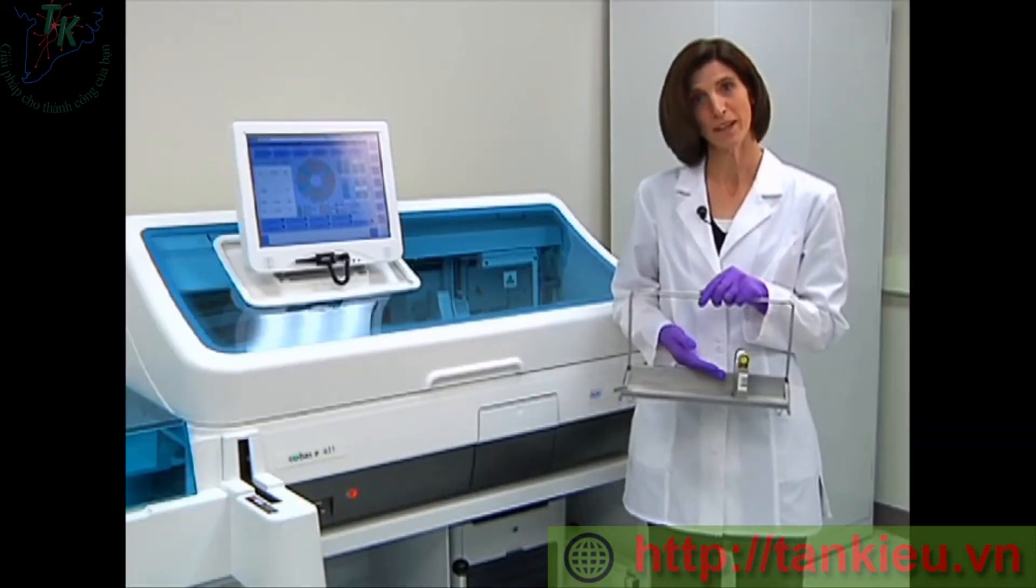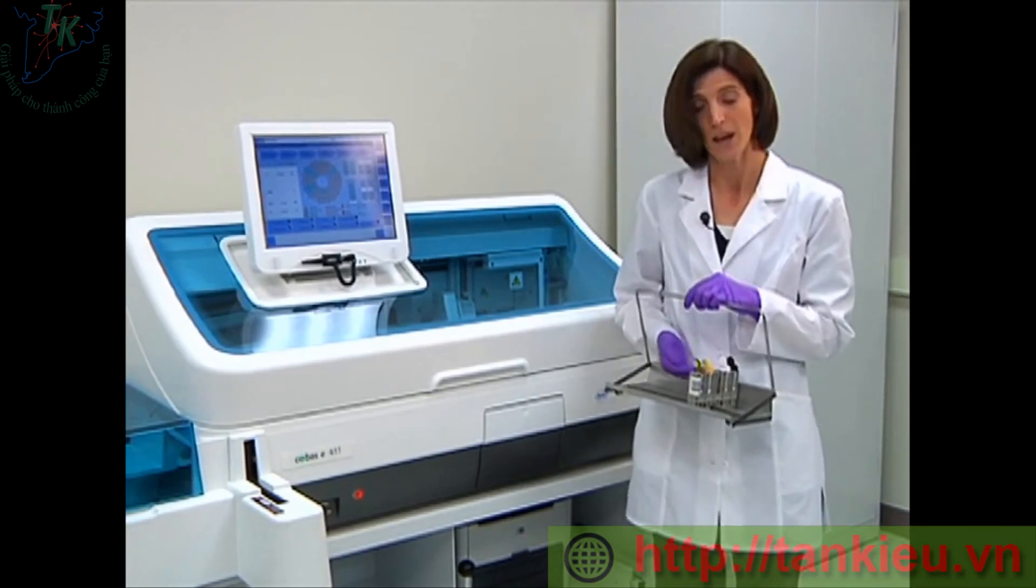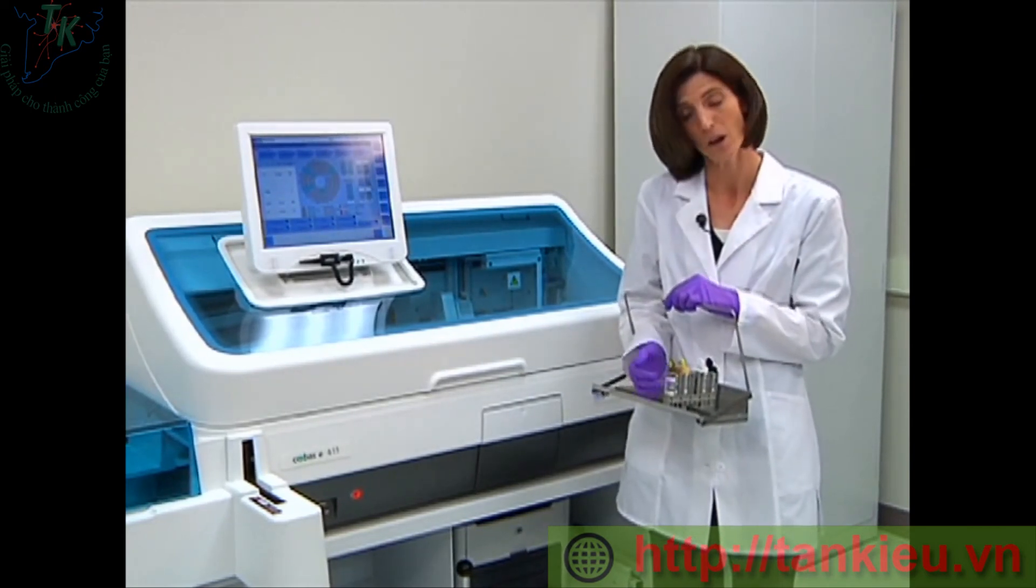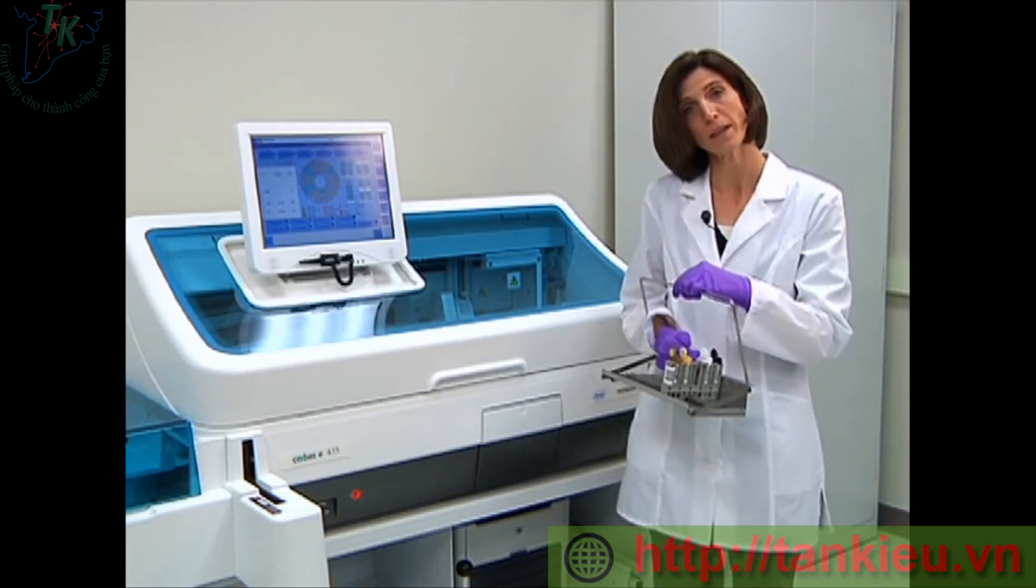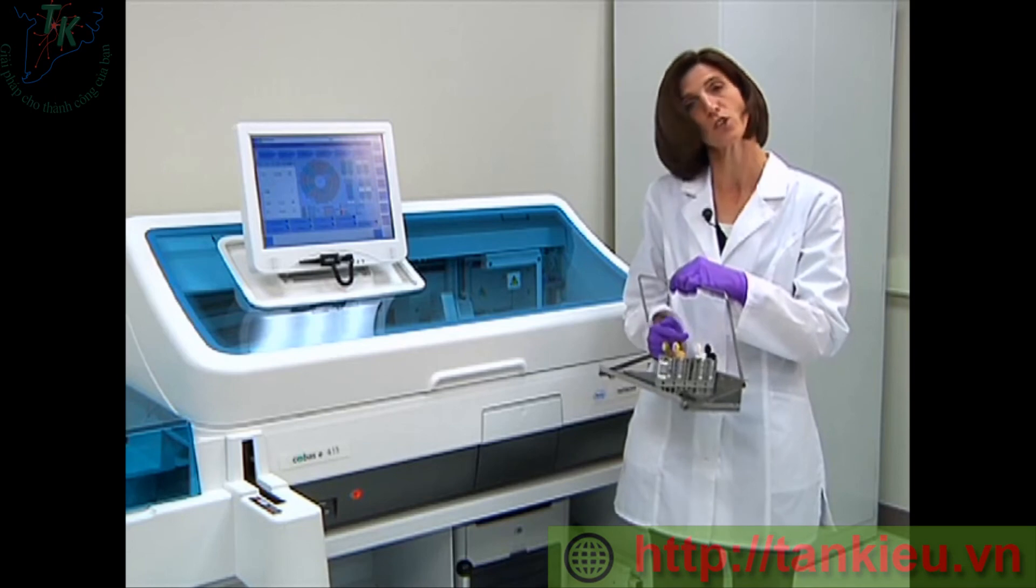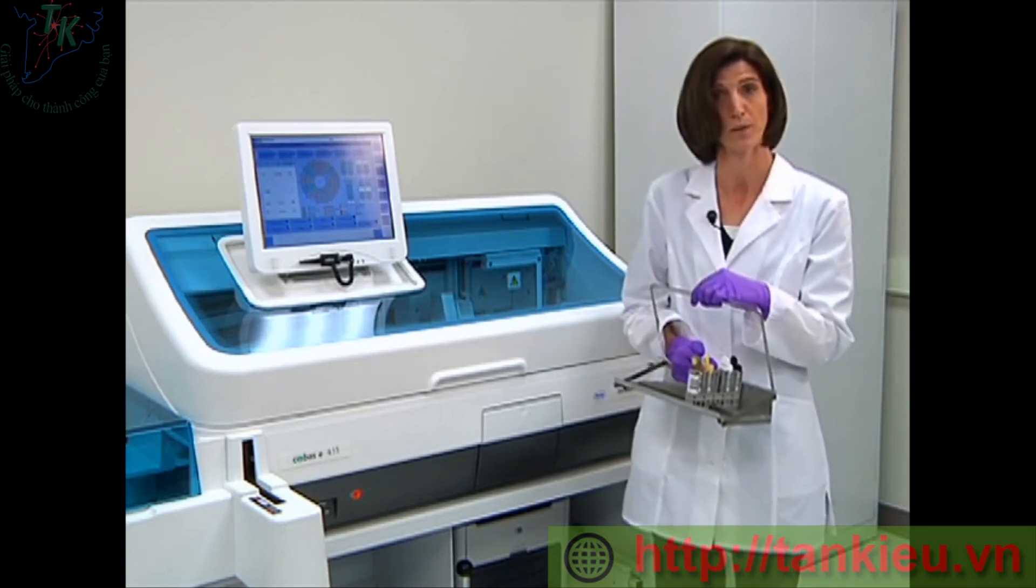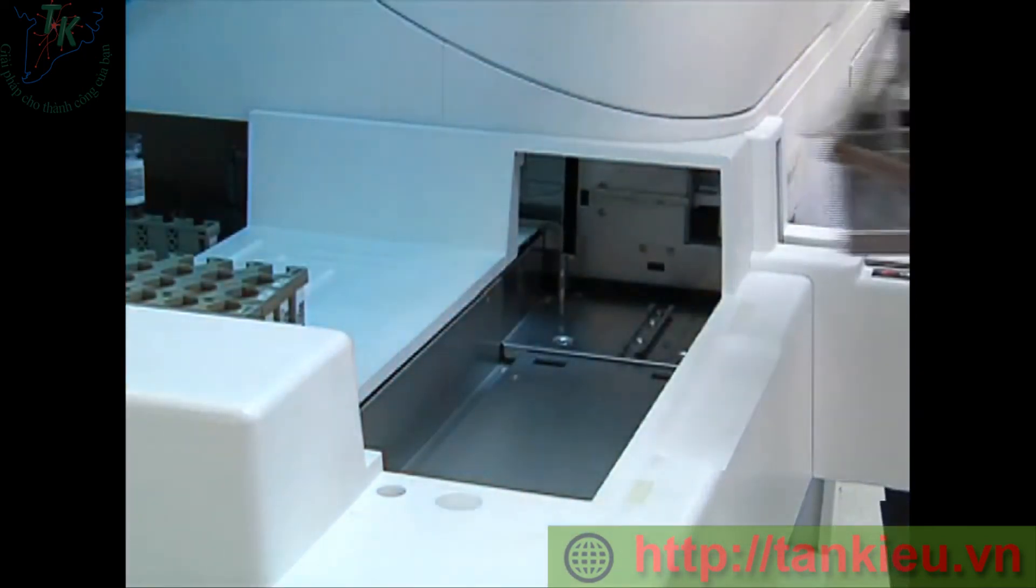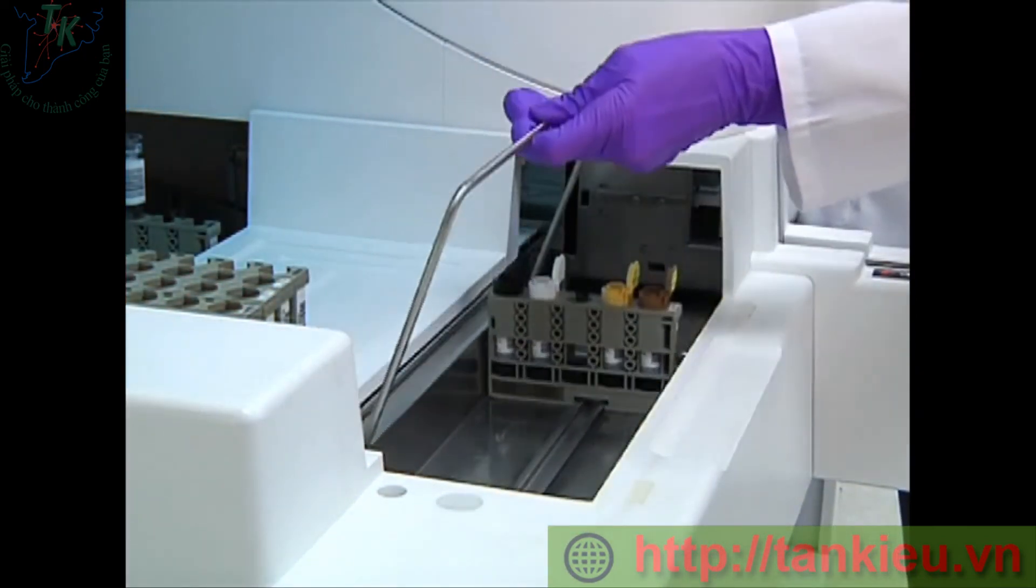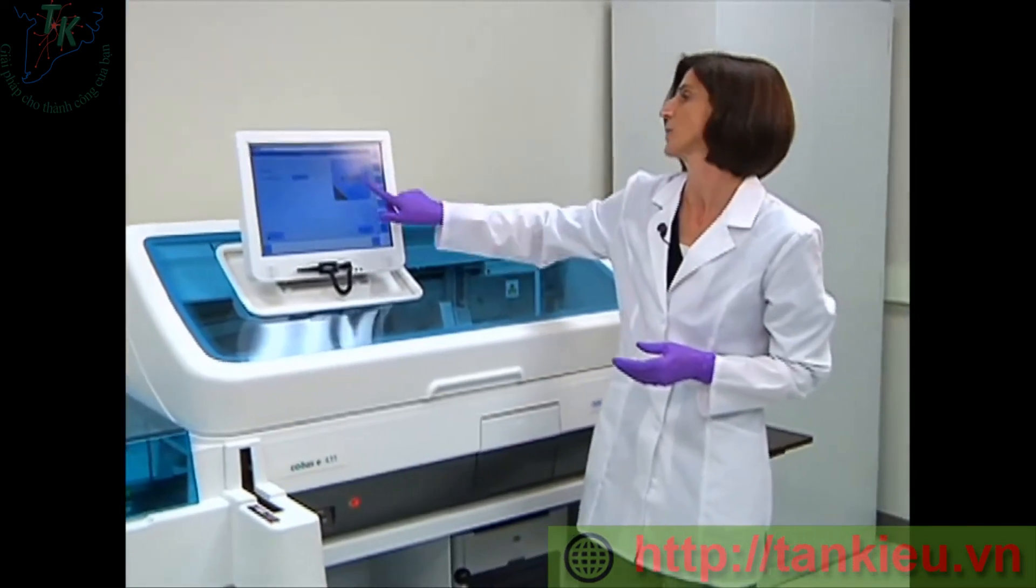Now I have prepared my calibrators and controls, and I have loaded them on a five-position rack. I need to make sure that the barcode is facing out and all my caps are open. Also, I'm going to leave a space in between my calibrators and my controls to make sure that I get QC run on all tests that are loaded. Now I'm going to load my tray. So I simply load the tray, close the cover, and start the instrument.